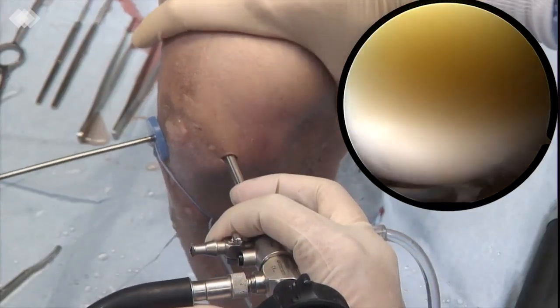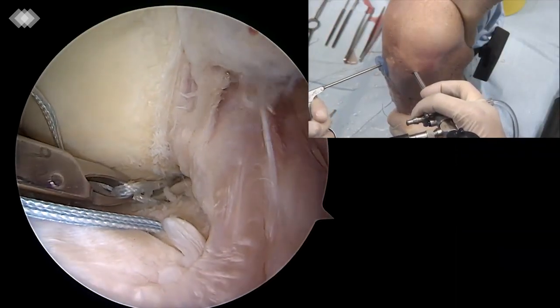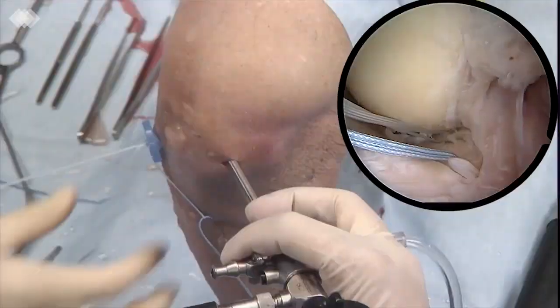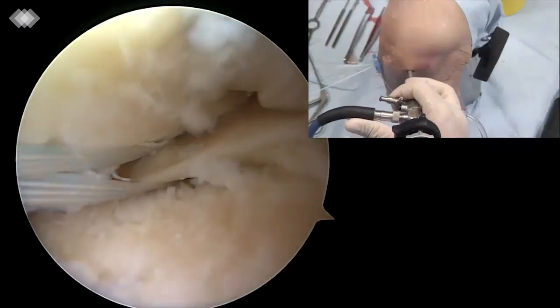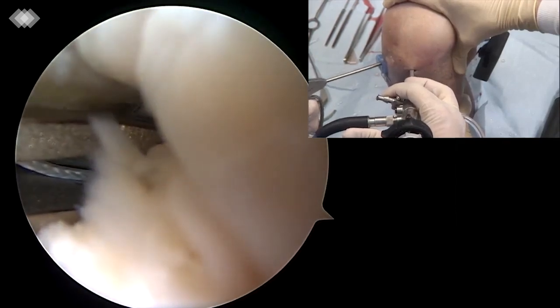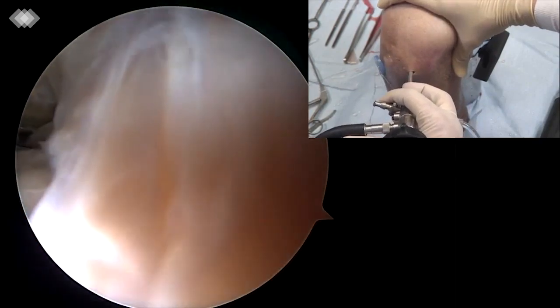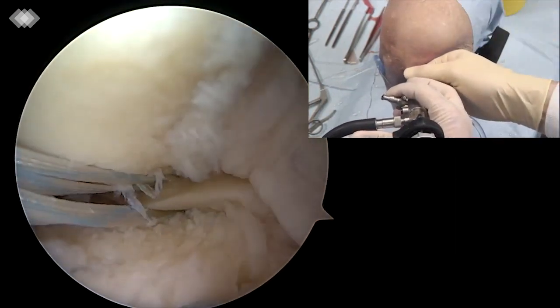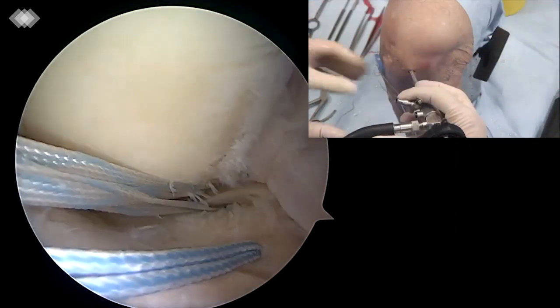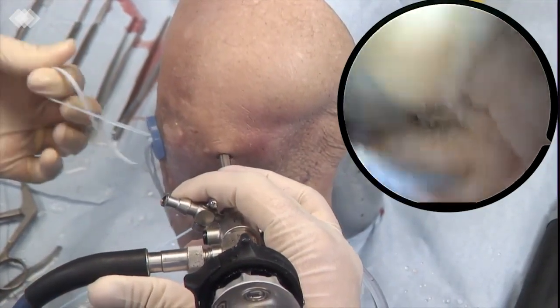A knee scorpion is used to tie the posterior horn of the medial meniscus at 2cm medially to the insertion, and a 1.3mm suture tape is passed through the meniscus. A second stitch is made 1cm medially to the first one, and another 1.3mm suture tape is passed through the meniscus. The suture tapes are then passed through the tibial tunnel.